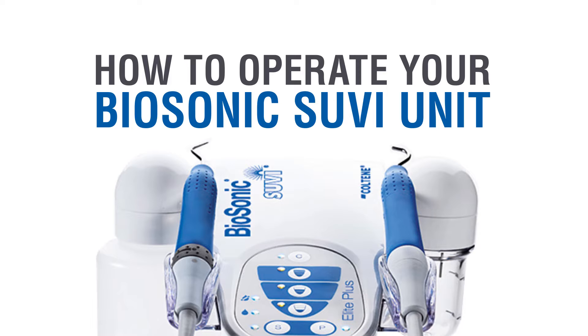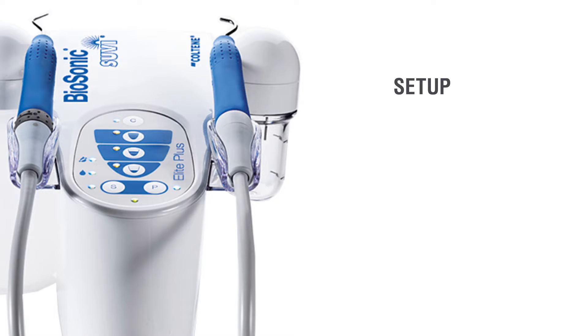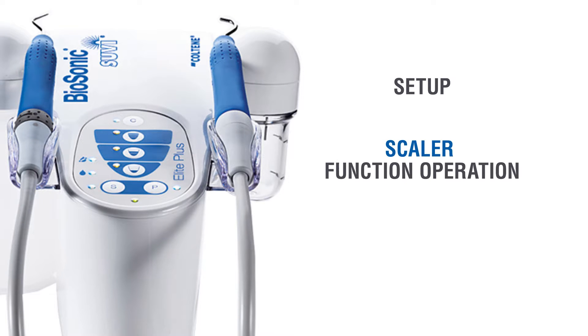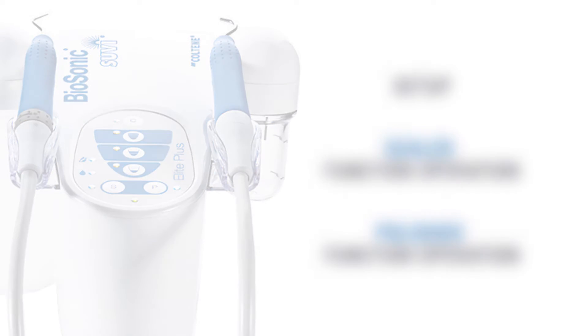This video will walk you through the proper setup of your BioSonic Suvi Elite Plus unit and how to operate both the scaler and polisher functions. Remember that it is crucial to sterilize all tips and nozzles prior to setup and use.